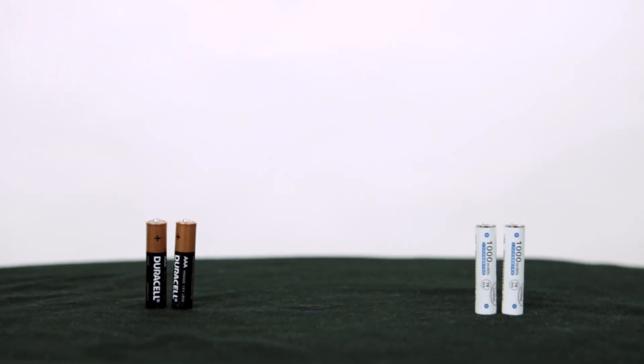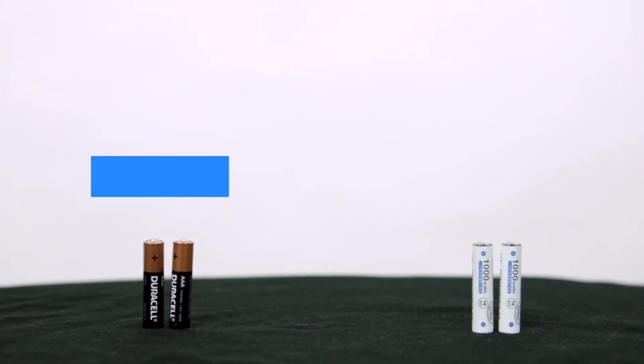Like the Virtual Field headset, the controller's battery life depends on your usage. If you do tests infrequently, like once or twice a week, then your batteries may last for a few weeks. If you do tests more frequently, then you may need to change your batteries more frequently. The controller takes two triple-A batteries.